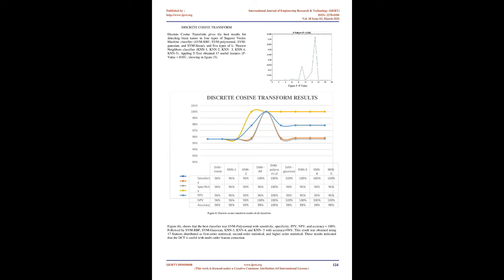In machine learning, there are some sequential steps that must be followed in order for the CAD system to perform properly. Figure 3 shows the processing blocks contained in our CAD system. Database source. To conduct this study, data samples were accumulated from the Kaggle website. These samples contain 144 MRI images of both malignant and benign cases. The samples were of different resolutions.